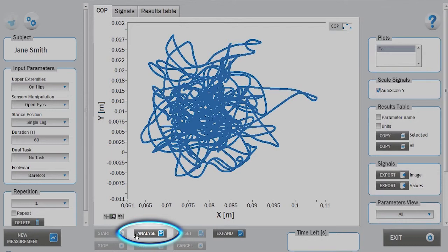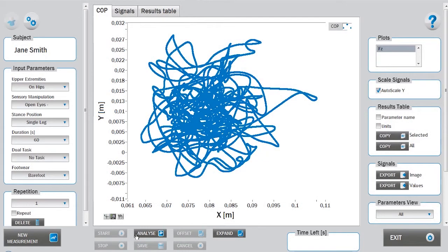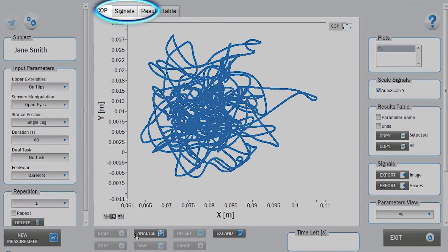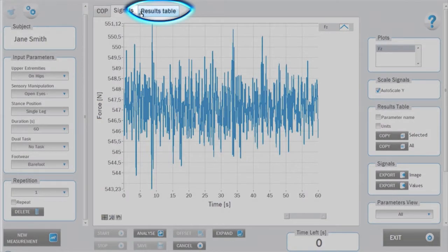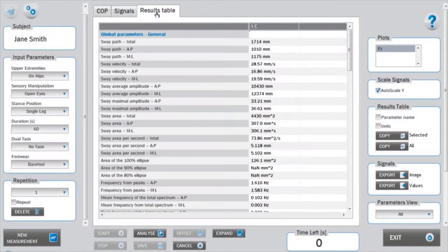The ground reaction force signal can be viewed under the signals tab. The data of the analysis can be viewed under the results table tab.